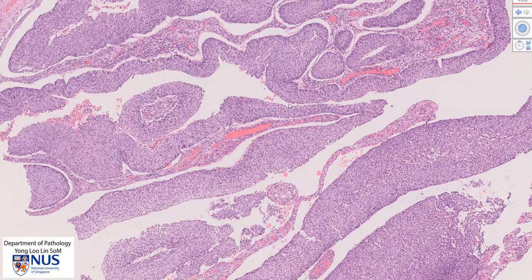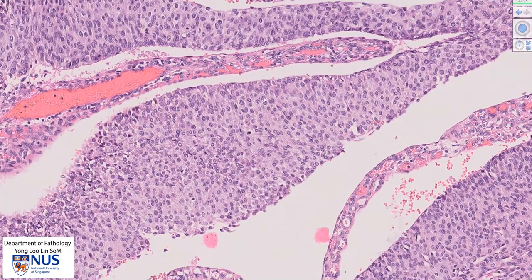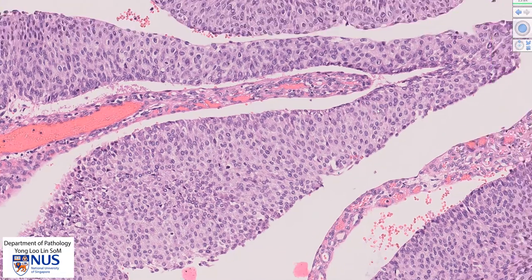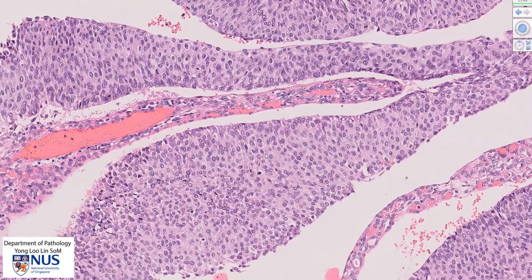The urothelium lining these papillary projections is very abnormal. There is loss of polarity — normally, the urothelium being stratified, we will see that the cells towards the surface appear a little bit more flat. In this case, the cells do not really appear to have gradual flattening towards the surface, so there is loss of polarity.